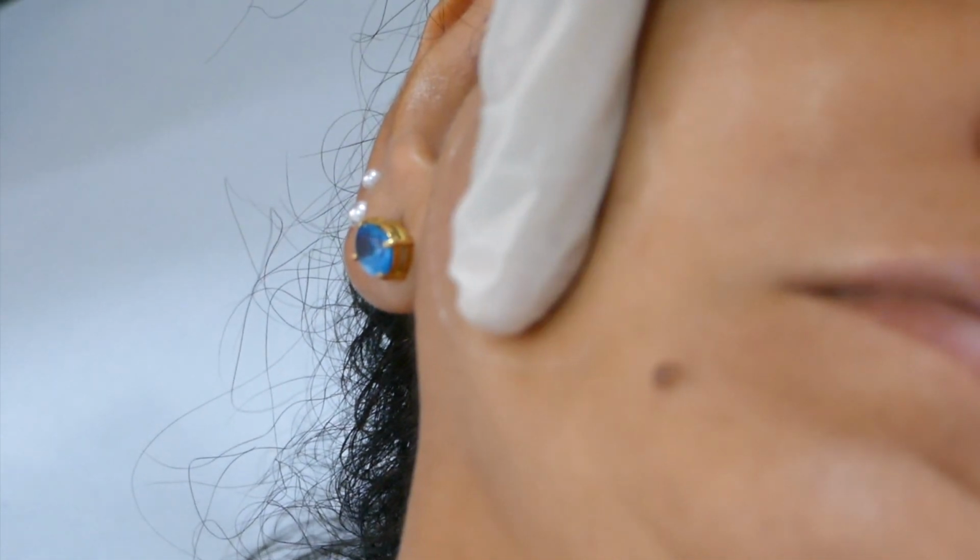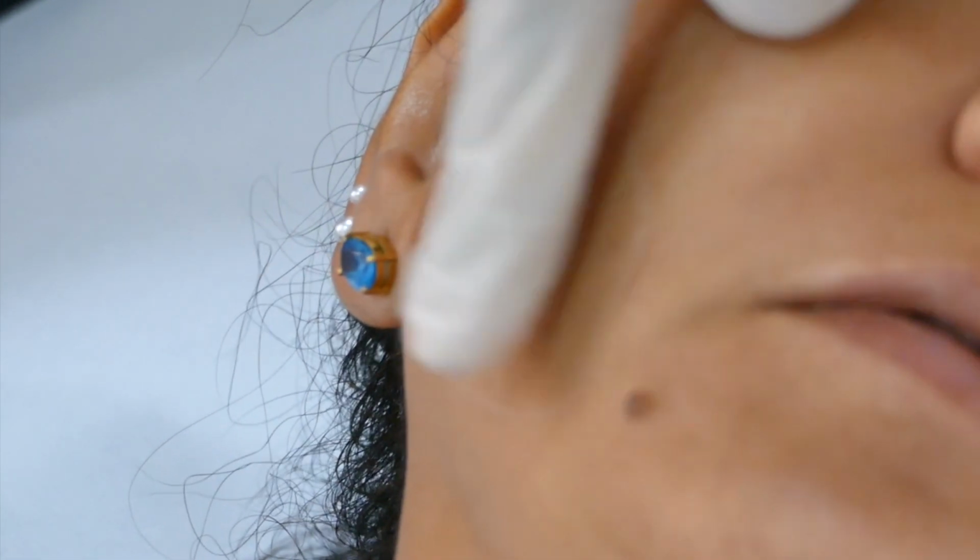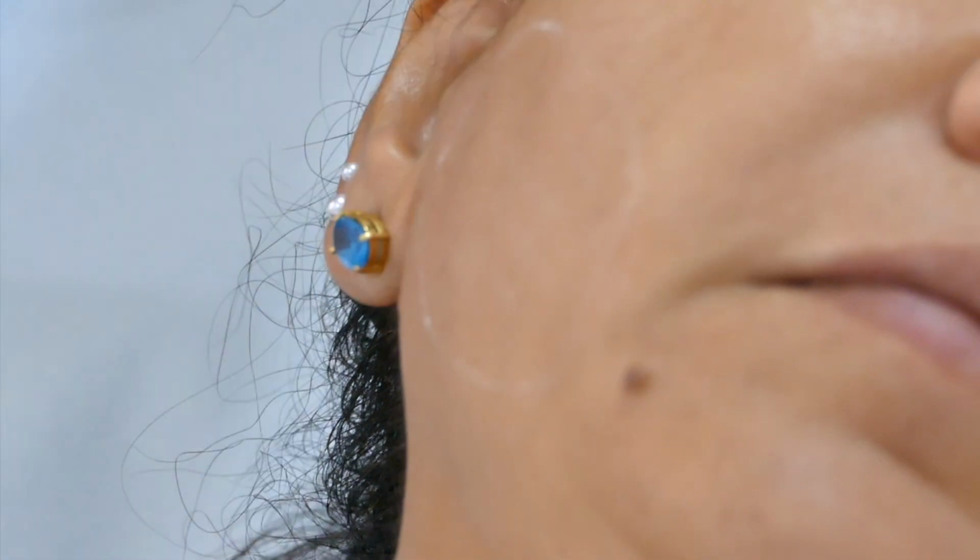That's it. And just gently spread the filler. That's it on this side.